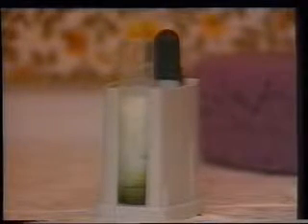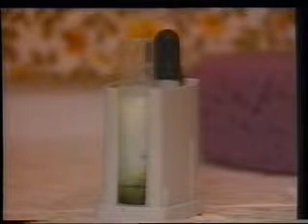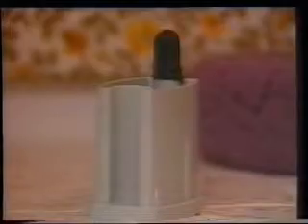The boiling stops, and after waiting 15 seconds, the tube can be removed from the holder. The mixture in the tube is then shaken gently several times in order to get an even colour, and the colour is compared against the Clinitest colour chart. Compare the colour carefully and note which colour block most closely resembles the colour in the tube. In this case, John has 0.5% sugar in his urine.